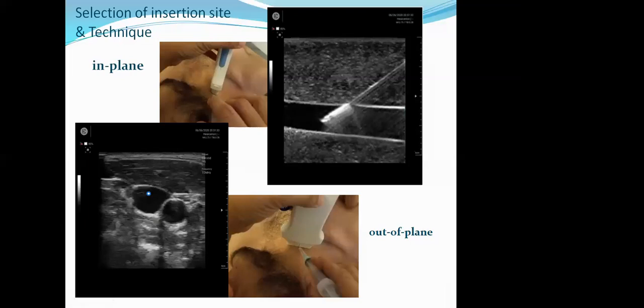When looking at the longitudinal and transverse planes, you look for any thrombus or any other pathology. It is very important to evaluate the vessel before performing the procedure. Now comes the important step: selection of the site.